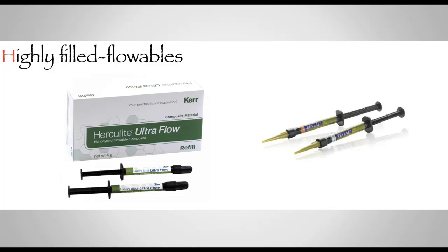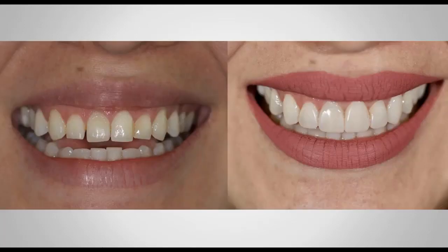You want that because you're going to use this prototype for a week, for 2 weeks, and sometimes when I use them to alter the vertical dimension, I have had these on my patients up to 8 months. So it really depends. You want to make sure that you have a heavily filled flowable composite so that you can use these restorations for a long period of time without having to repair them frequently. So that's very, very important. And just to show you a quick photo, this is one case that I did on a live continuing education course.